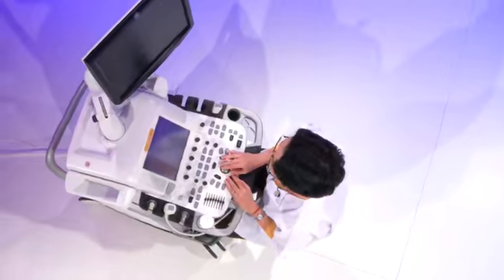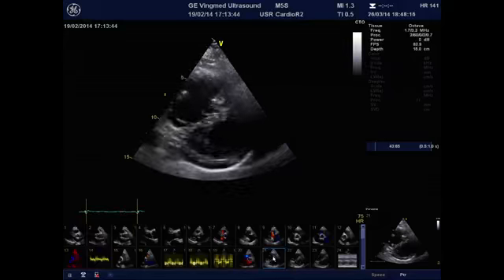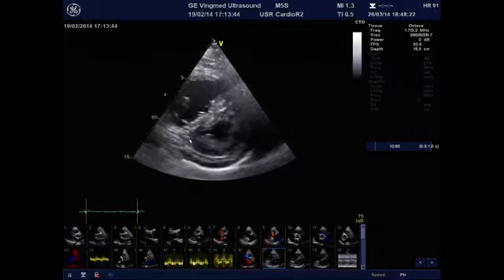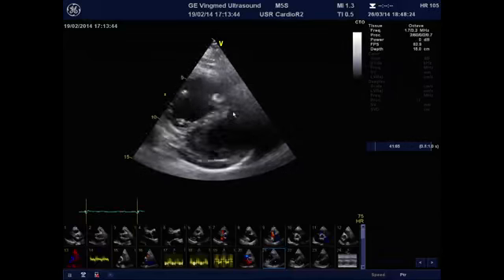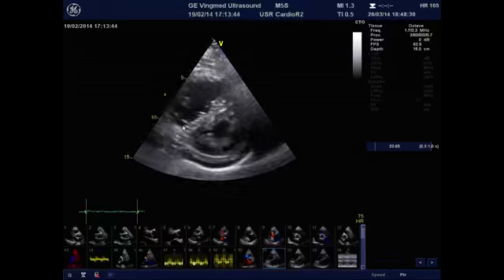This is very relevant because these patients can benefit from specific pulmonary vasodilator therapy. I will begin by showing you the most prominent feature of her 2D exam. From the parasternal short axis, you can see how her interventricular septum is flattening both in systole and in diastole due to a significant pressure overload of her right ventricle.